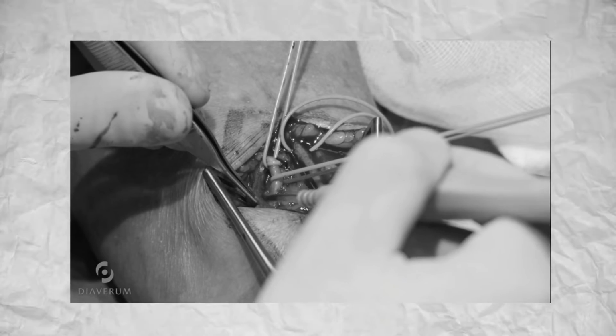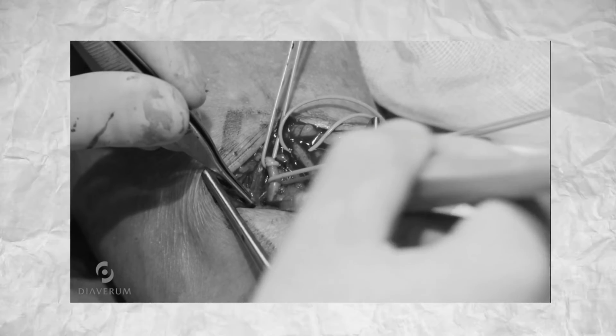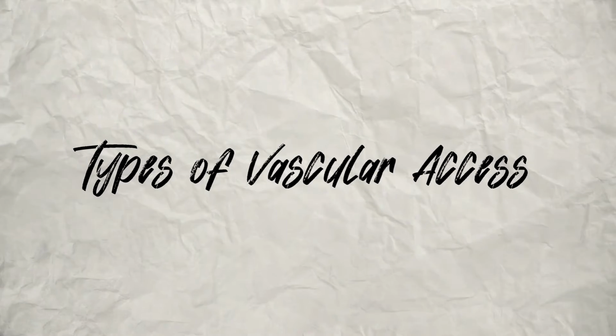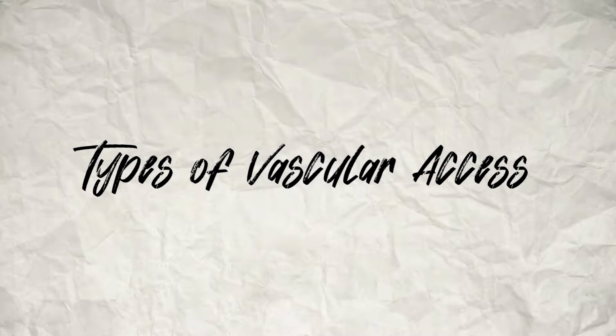The preparation ideally starts several weeks to months before dialysis is necessary. However, if the need for dialysis is urgent, there are options for access which can be used immediately. And these are the three types of vascular access.